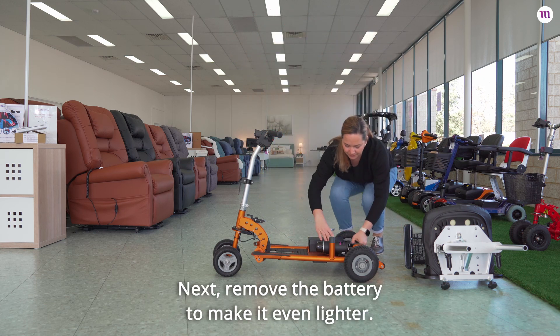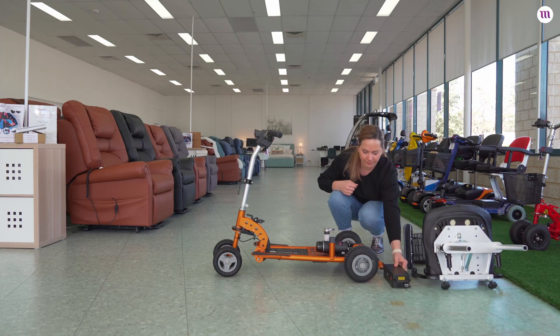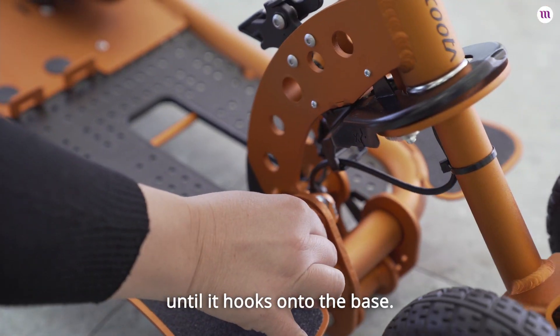Next, remove the battery to make it even lighter. Simply pull the latch and lift the battery out of the base. Next, pull the black knob and lower down the tiller until it hooks onto the base.